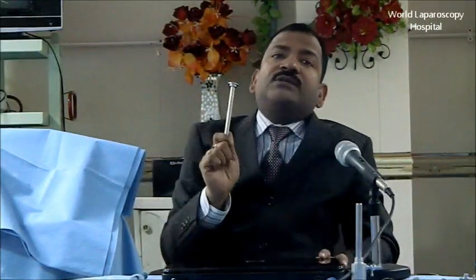From the center of the monitor, you should be 5 times the diagonal length away. Now the question is, why 5 times? Because if you want to see anything better, that object should fall over the macula of the retina. In the retina, the central part is the macula, which has a high concentration of cones. Cones are responsible for color perception, resolution and acuity of the image.